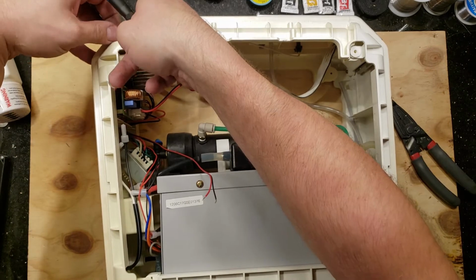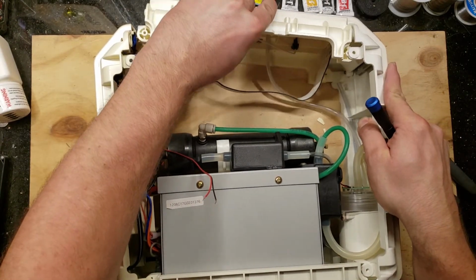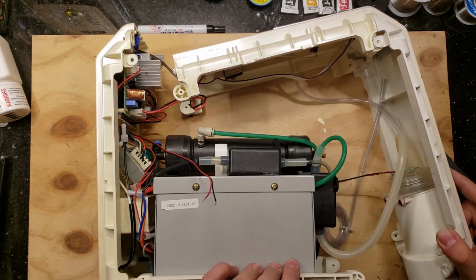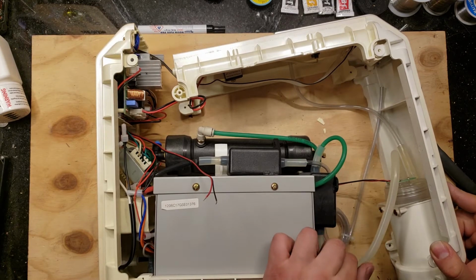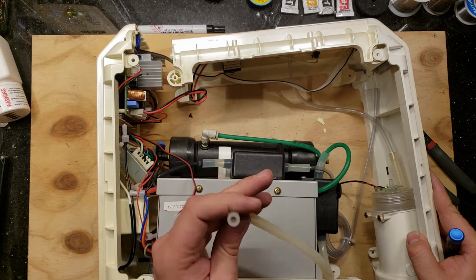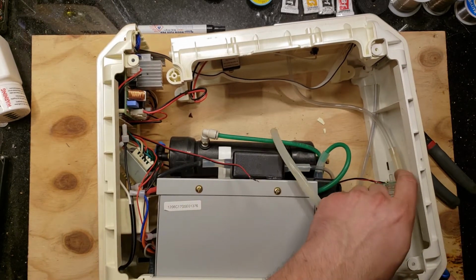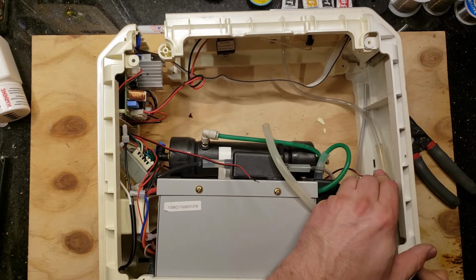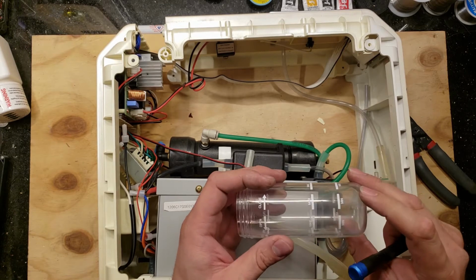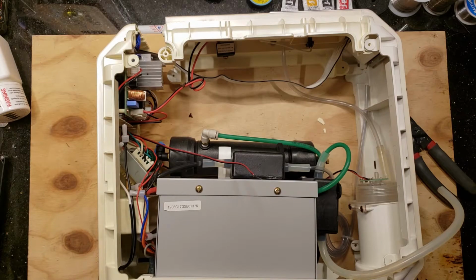Okay, so this may have some more screws. All right, so it looks like the output of this is going into this bubbler right here. So this is going to be our main output that we should be testing. And then this has a little can where they would put flavored water to give you different smelling air. Yeah, smells bad.